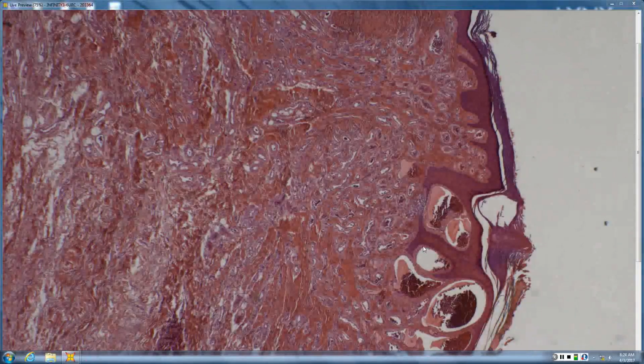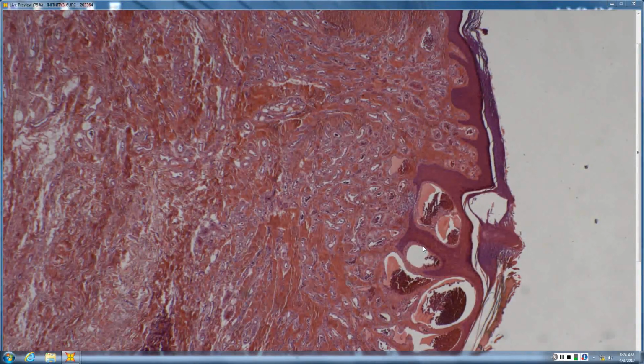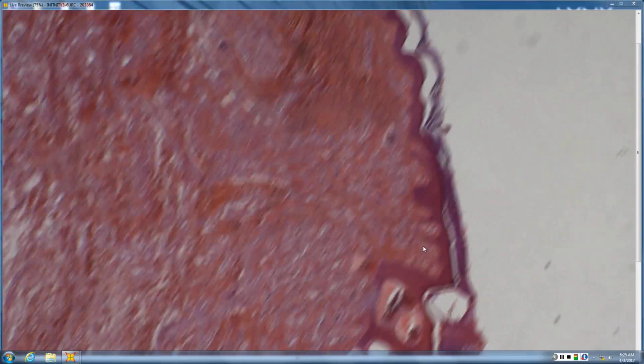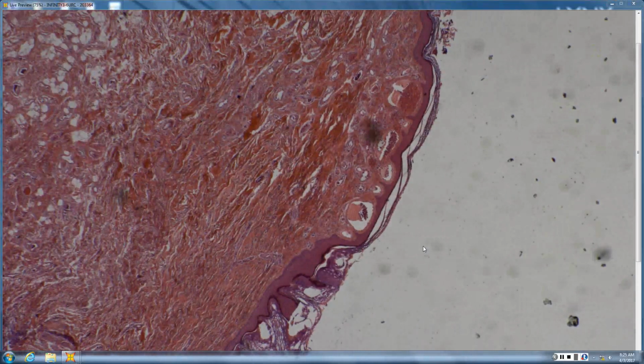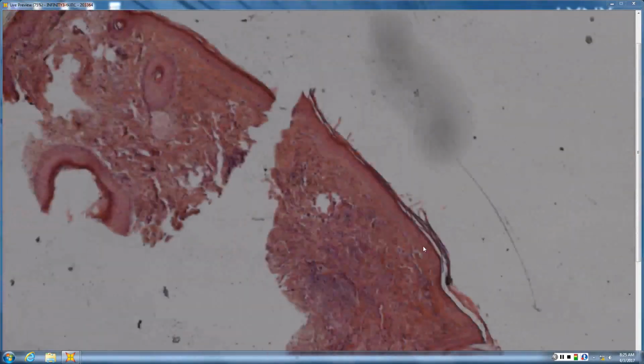Is it lobular divided by septi, or is it more diffuse in the dermis? It's lobulated divided by septi. I'd go the other way around. I'd say it's through the dermis instead of being discrete nodules with septi in between. And it's almost like an angiokeratoma up in the papillary dermis, but it goes deeper too, and it definitely has a verrucous surface. So do you know any kind of verrucous hemangioma? Yeah, verrucous hemangioma.